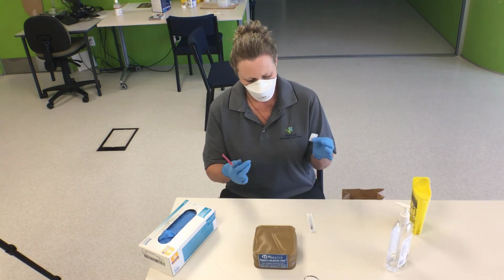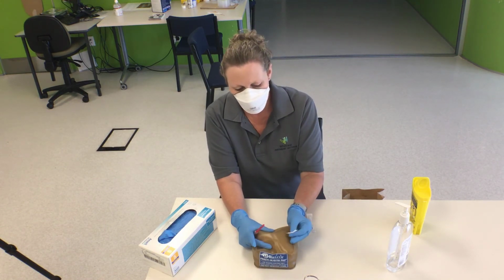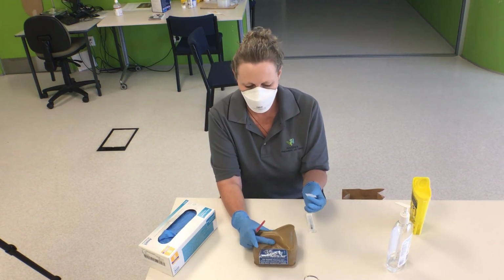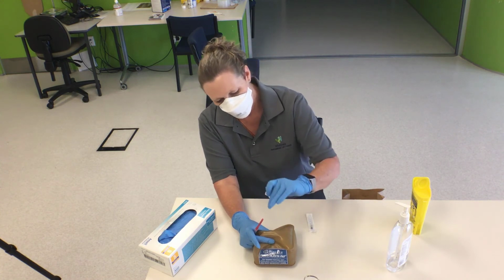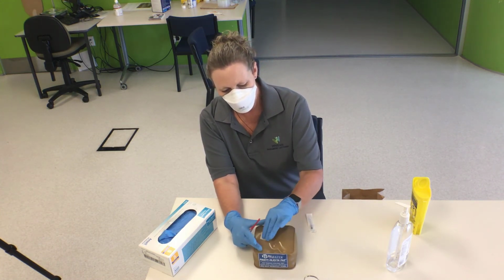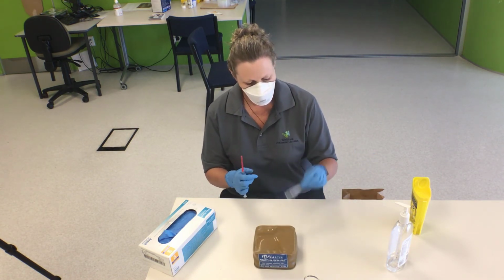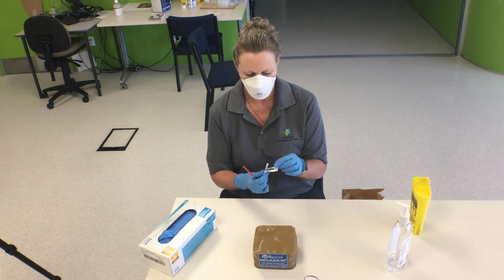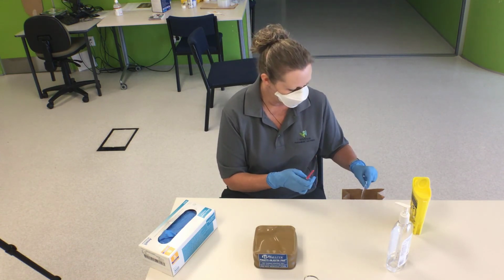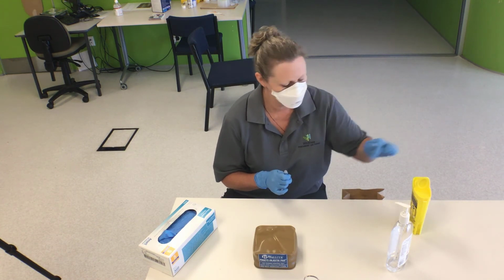And you'll notice that all of this time I'm not putting this medication down. With a subcut, it's really important that we're pinching up the area so that we're not going into the muscle like an intramuscular, and we're going round in a circular motion. So I am now about to change out my blunt, and even though it is a blunt, it still goes in the sharp container.